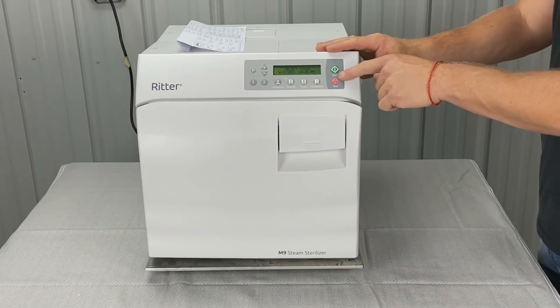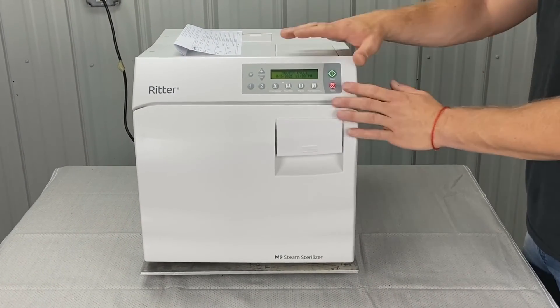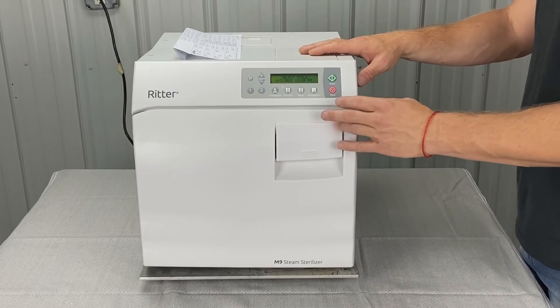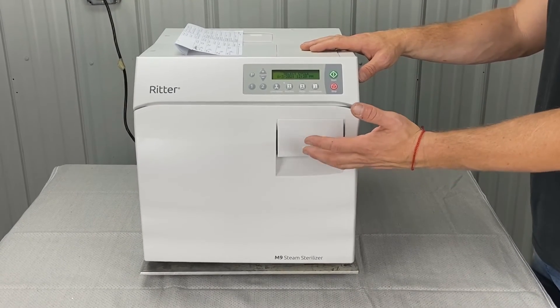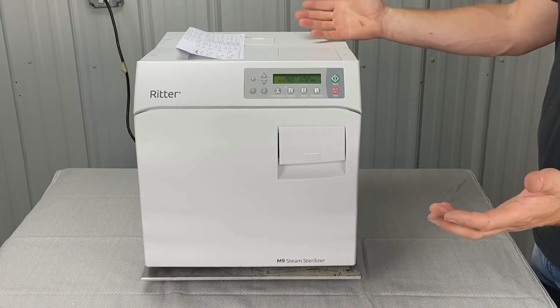That could be a reason why your stop button is going bad. If you get this error code, hit the stop button, maybe let it cool off for five minutes, shut the door, and run another cycle. See what happens.